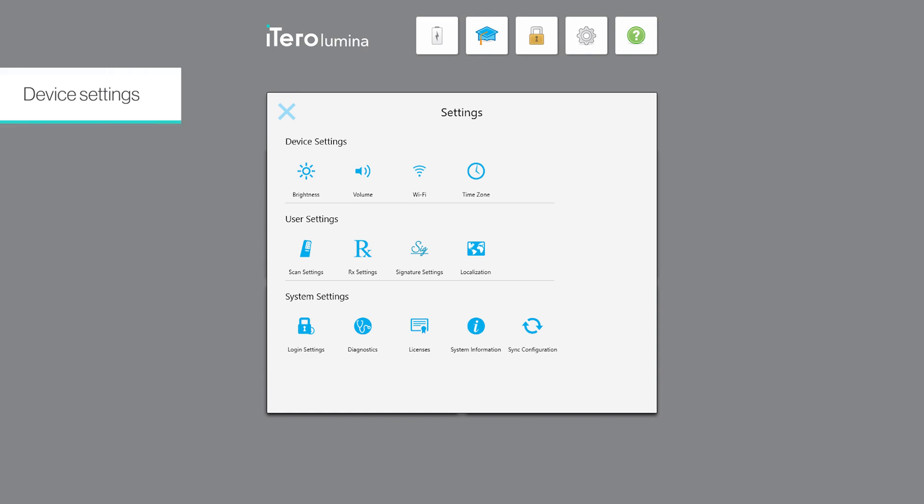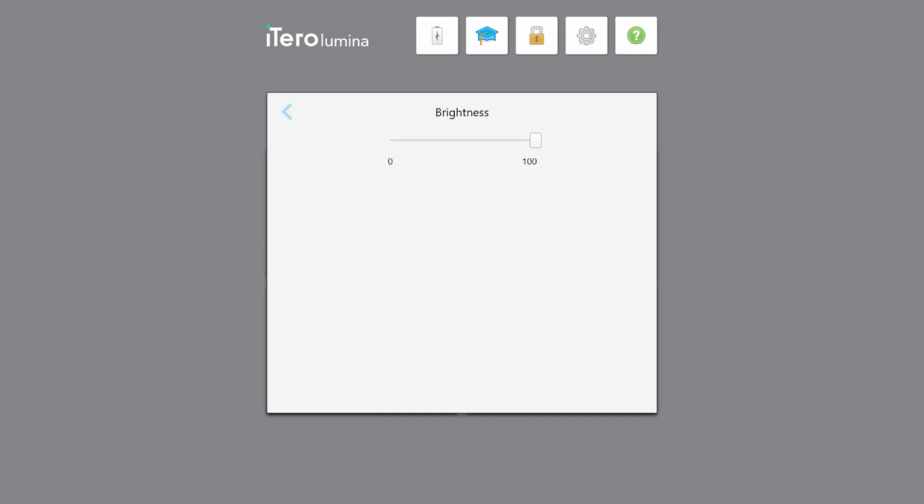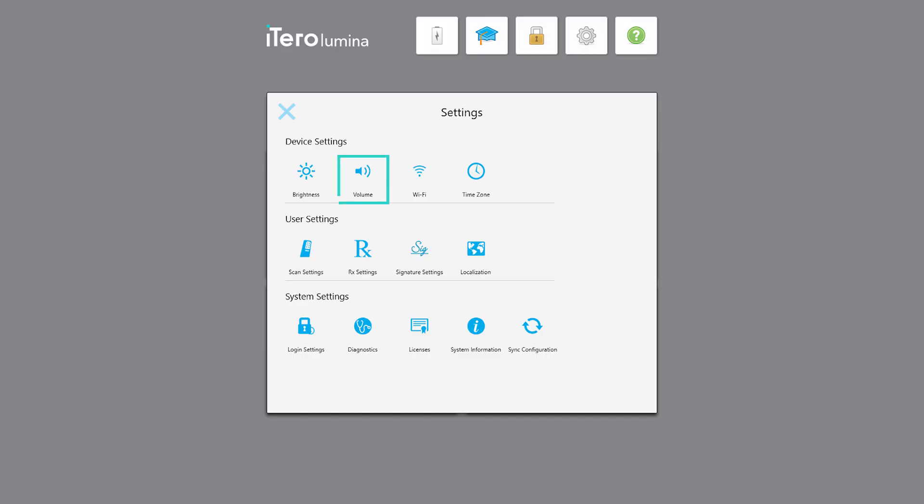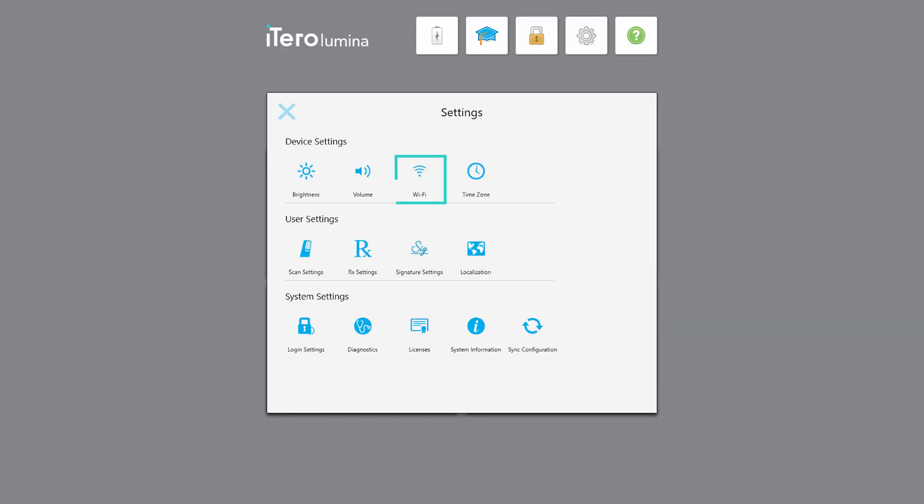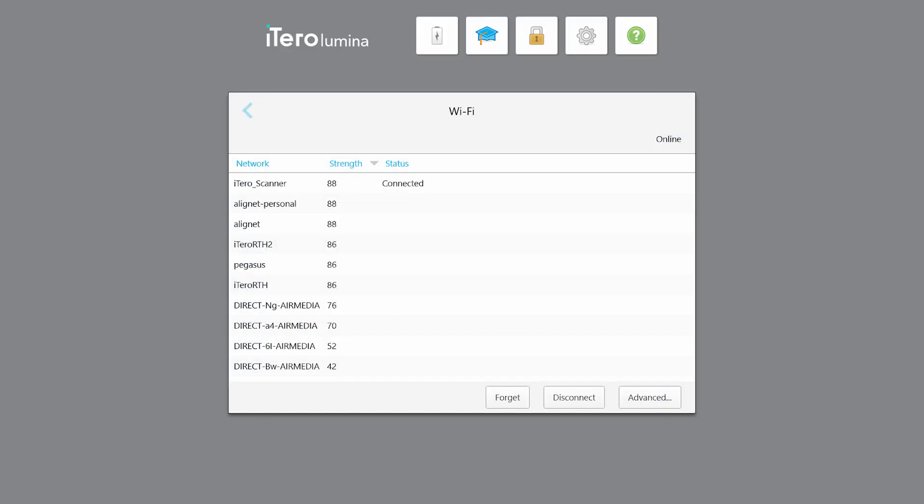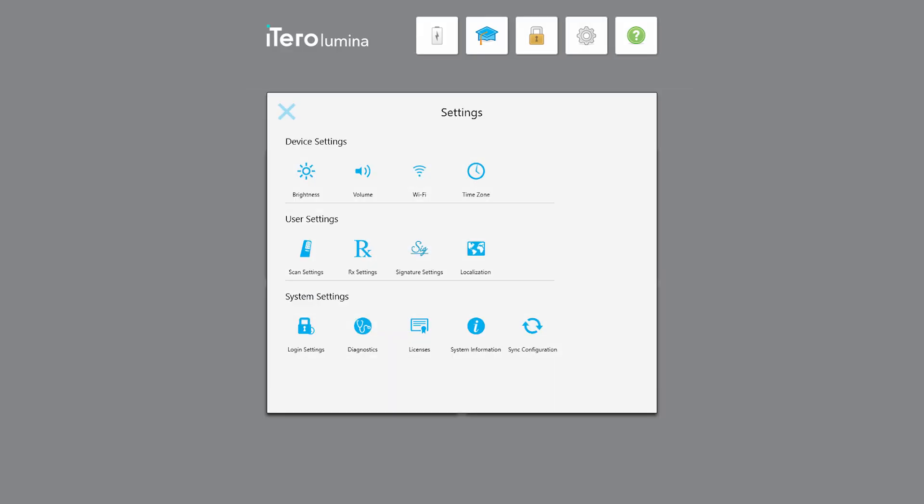In the device settings you can adjust the brightness level, adjust the system volume level, connect to a different Wi-Fi network, and select a different time zone.